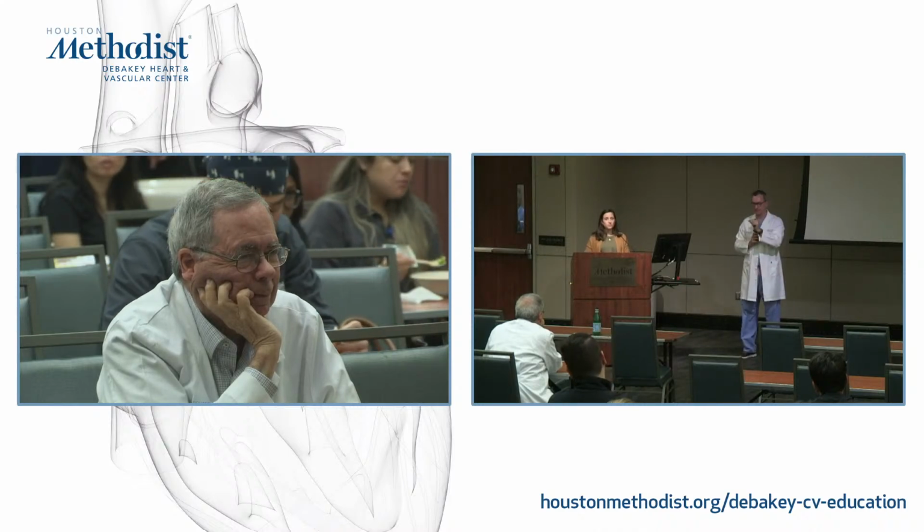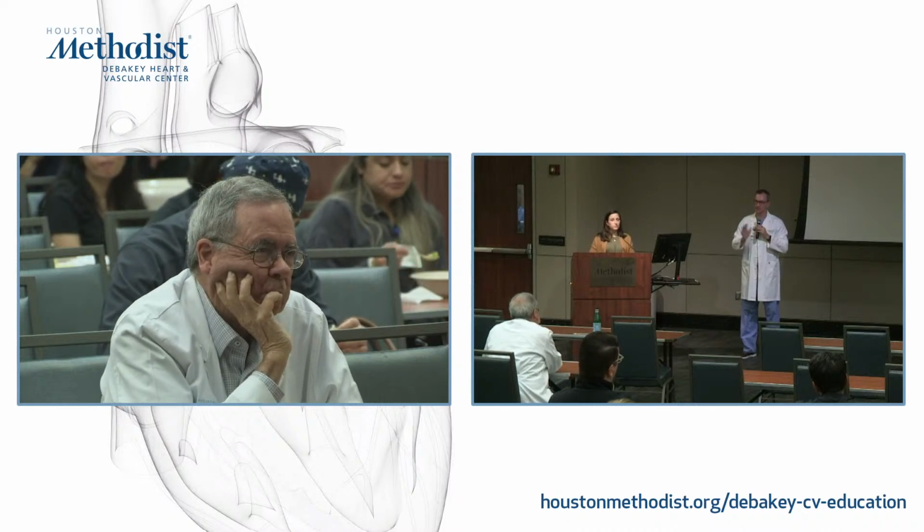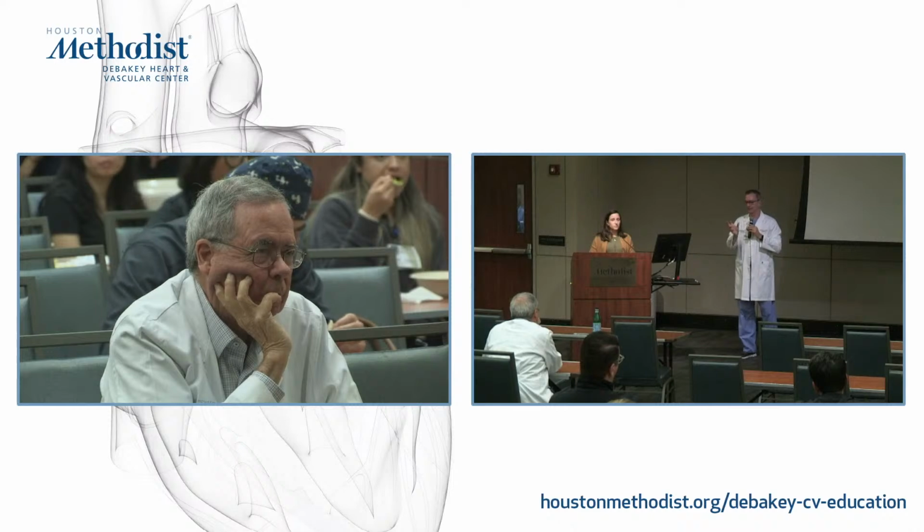You could close each arm singly. The catheter was actually designed for it. But it was very conservative because it's a trial. You want good outcomes, so they would exclude all big gaps.